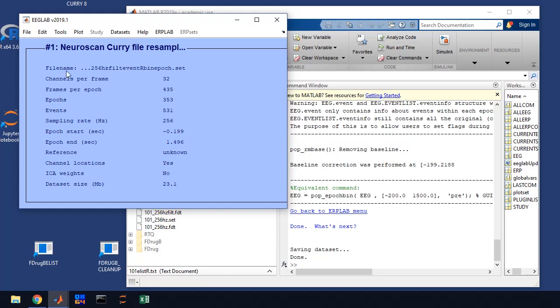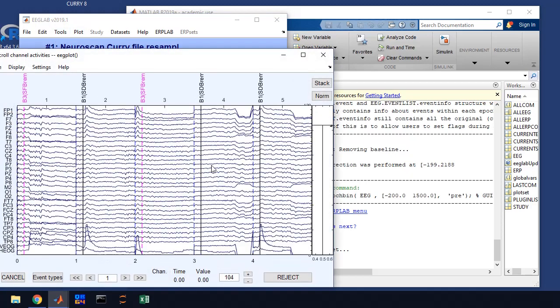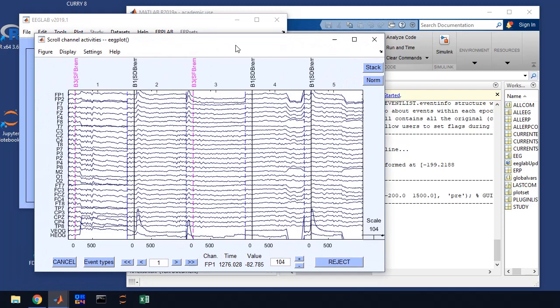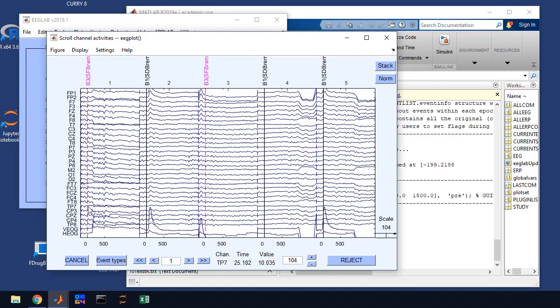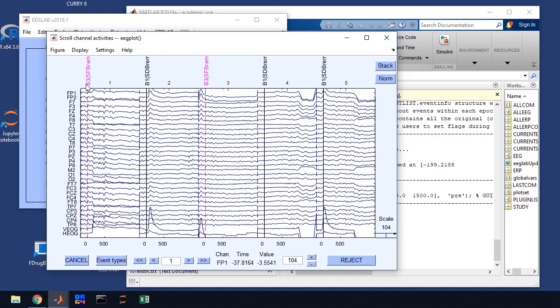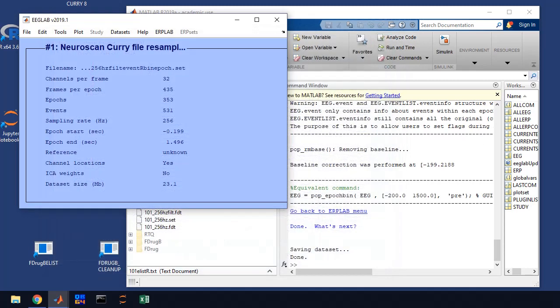Let me show you what it looks like real quick. So we'll go to plot channel data scroll. Now we don't have that extra time stuff. Time zero is when the stimulus was presented. We have 200 milliseconds before, 1500 milliseconds afterwards. So the total length here is 1700 milliseconds. But then we have the next epoch and you can see it's binned. So this was assigned to bin three. This was assigned to bin one and so on. So we're getting that one closer step to making ERPs. Essentially, we're going to average ERPs based on our bins. So that's the end for this step and the next step, we're going to remove artifacts using ICA.